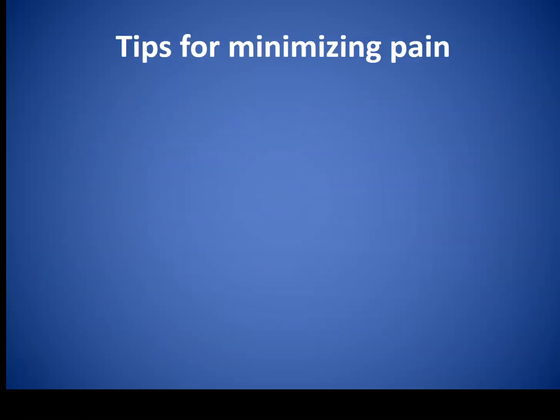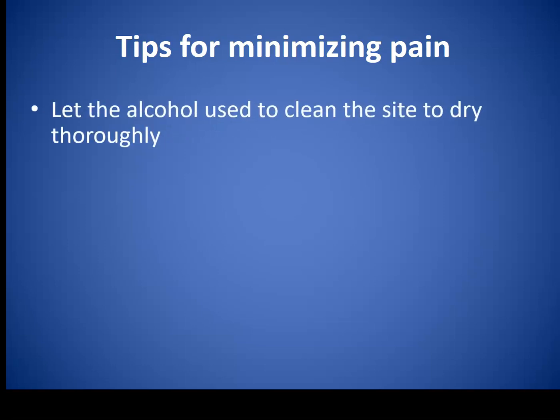Tips for minimizing your patient's pain. Always let the alcohol that you've used to clean the site dry thoroughly. I see this happen all the time out there. People are in a hurry and they just give a quick swipe of the alcohol wipe and then boom, stick that needle in right then.